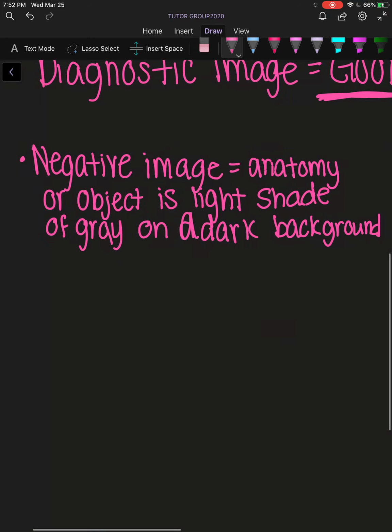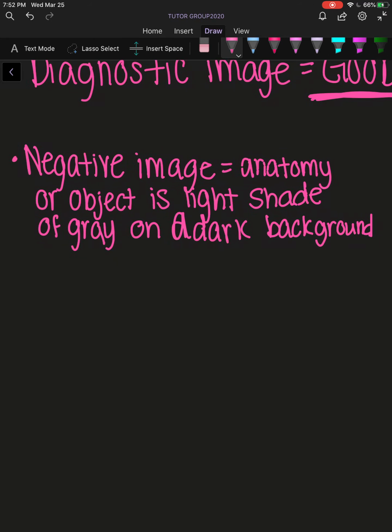Now, at some hospitals, the radiologist might require you to transform it at the computer to a positive image. And it shows the same exact amount of anatomy and everything. It might help the radiologist see something maybe he thought he wouldn't see on there. And so whatever institution or hospital you go to, the radiologist is going to pretty much choose what you need to do.